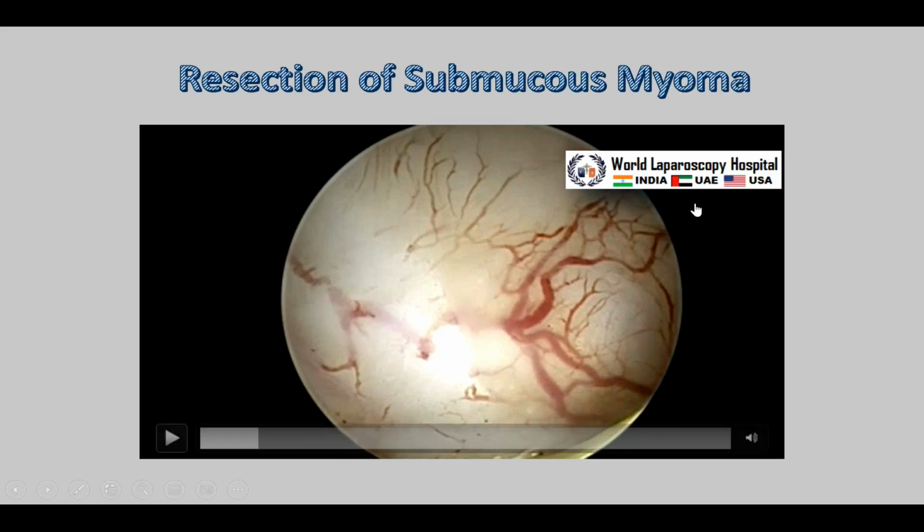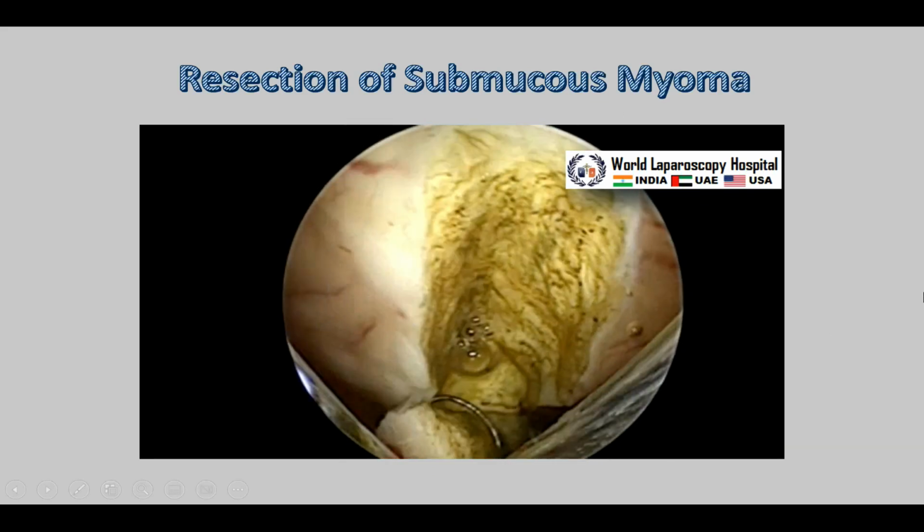So the head of the camera, these buttons of the head of the camera, should always look at the 12 o'clock position. The cable should look at the 6 o'clock position, always in every surgery. Laparoscopy, cystoscopy, thoracoscopy, vitreoscopy, axilloscopy, retroperitoneoscopy, whatever. What only you are rotating is the telescope. So for the anterior wall, your resectoscope telescope will rotate like that. For the posterior wall down, for the lateral wall this, and is it okay? So this is important. And this is the anterior wall, so the CCD is the same, and this electrode, and then slowly you will resect.